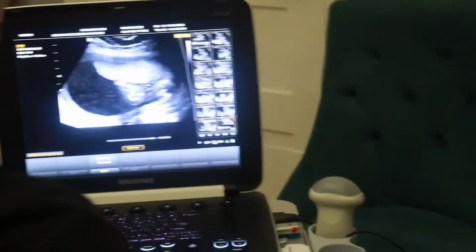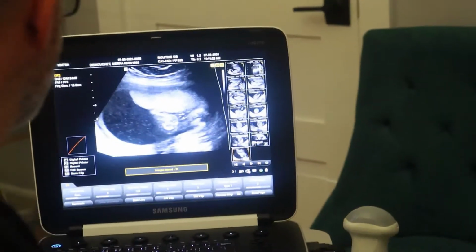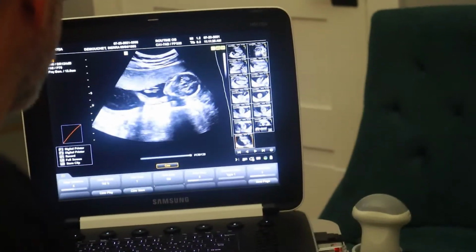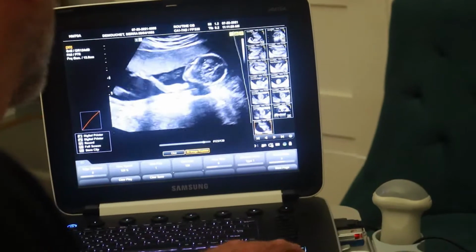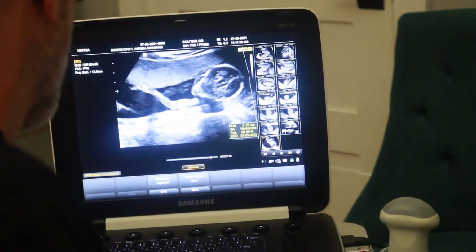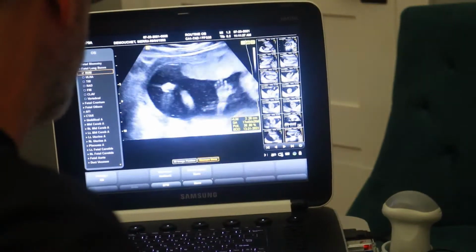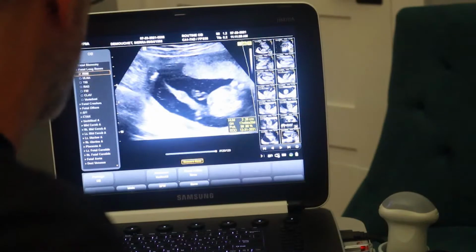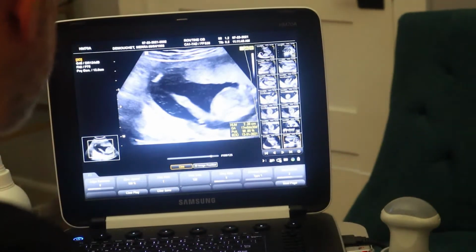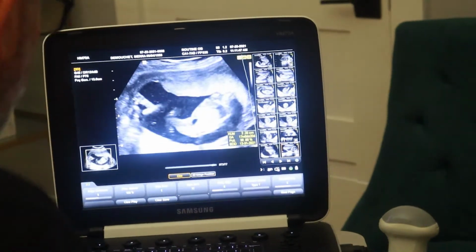Oh, there it goes. That is the upper arm, the little humerus bone. Little femur bone, that's the upper leg. That's the one that be kicking me. That's the one I see.